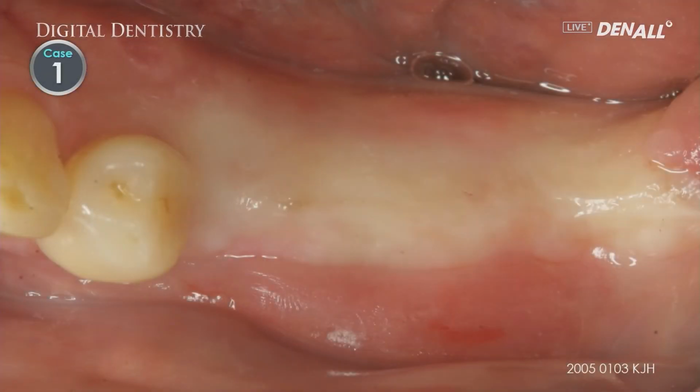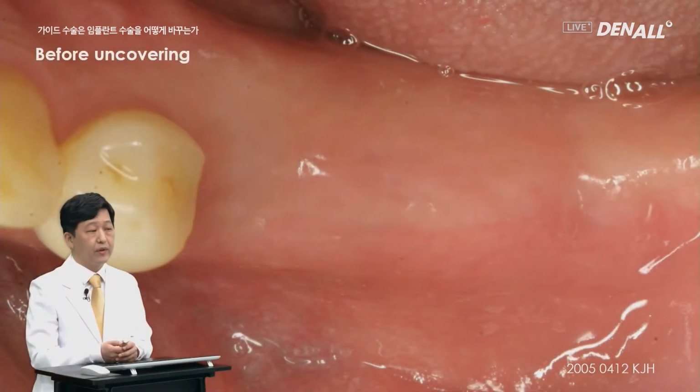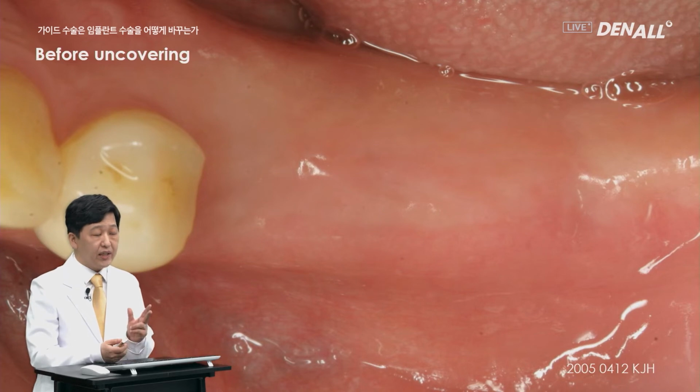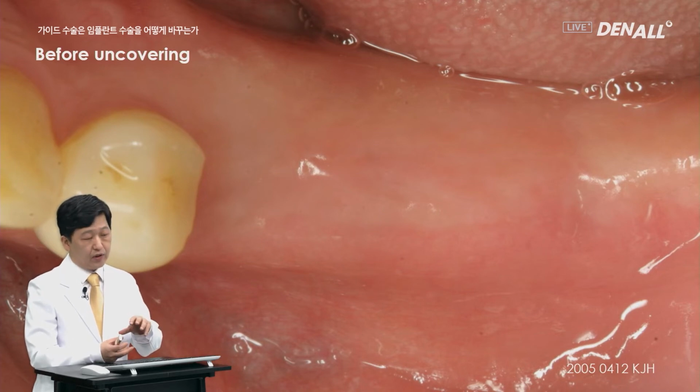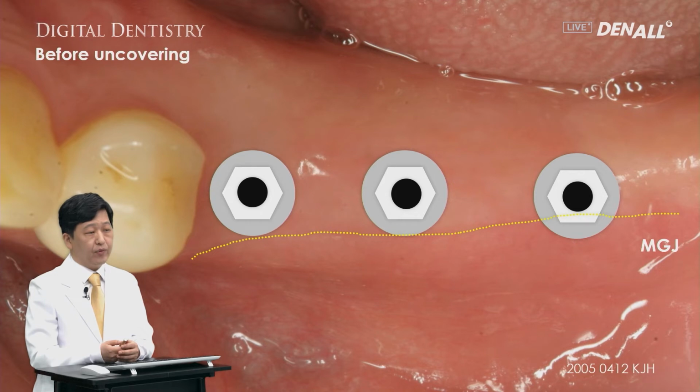This was implant surgery done quite a while ago. A flap was reflected in a traditional way, and three implants were placed. After 3 months, secondary surgery was done. Healing abutments were to be connected. As shown, this is the line of the mucogingival junction. The position of the implant is beyond the mucogingival junction.